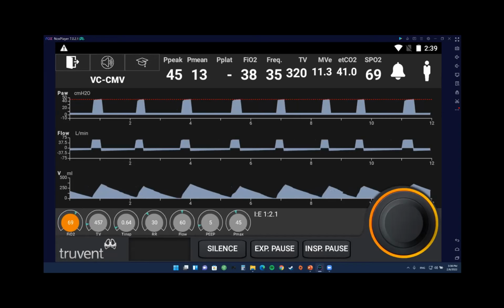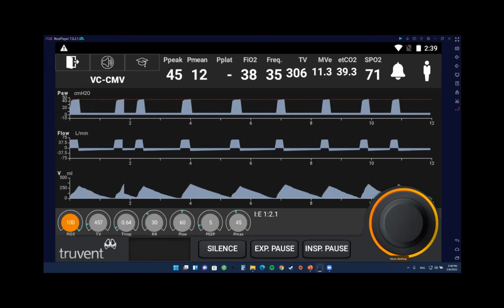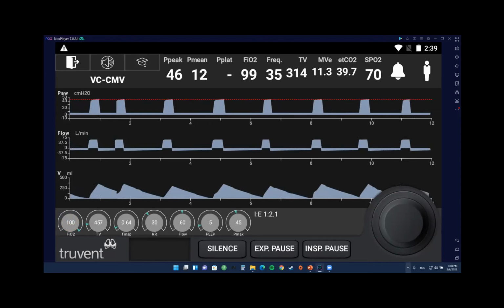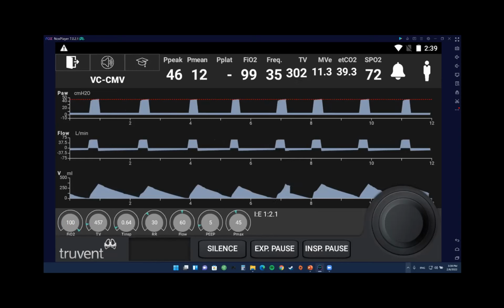Good. And that's exactly what I needed to hear from you guys, because I've seen this in real time so many times: a patient is desaturating and someone doesn't want to be aggressive and they go from 40 to 45 or 50 because too much oxygen is bad. My response to that is also, hypoxia is not good for you. So whenever you have a patient crashing in front of you and desaturating, never negotiate with oxygen, just crank up the oxygen.